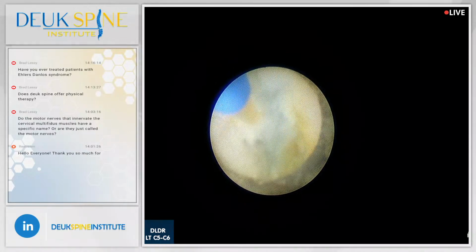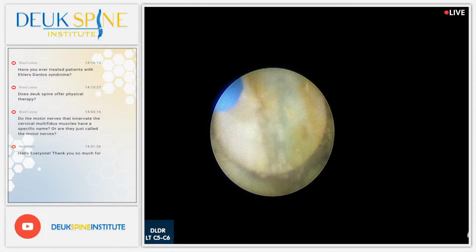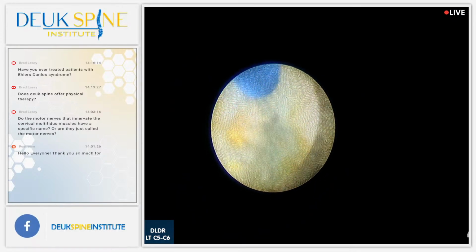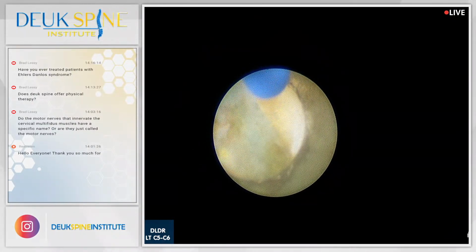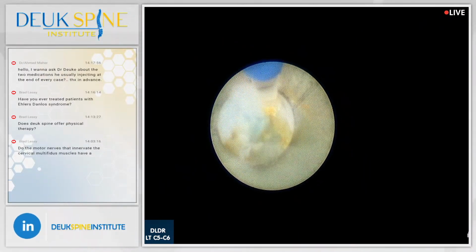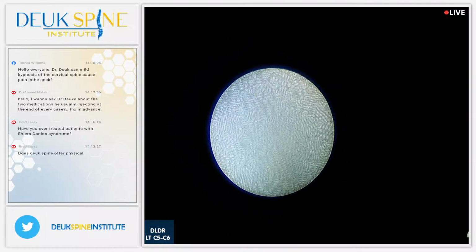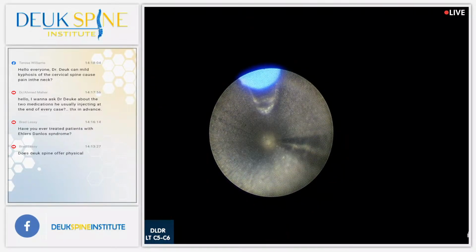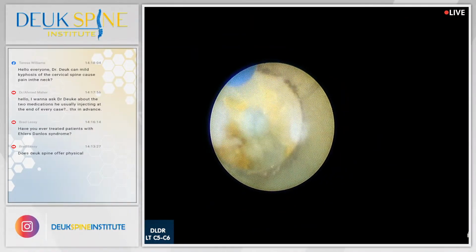Is it really autofocus? I did talk to an engineer, and he said that our camera components on the inside have the motor box and the gear control, which is what controls the auto exposure, and we do have that capability automatically inside our camera system. So you're saying we could set it to a level and hope that the computer does it every time? The auto exposure happens automatically depending on what type of light is filtering in through the prism that I was talking about earlier. Then all of your fine-tuning details, like brightness and contrast, we can kind of mess with. So maybe we do this again with an engineer to help us as far as adjusting, because this is overexposed right now. I can adjust that from the screen, the brightness.